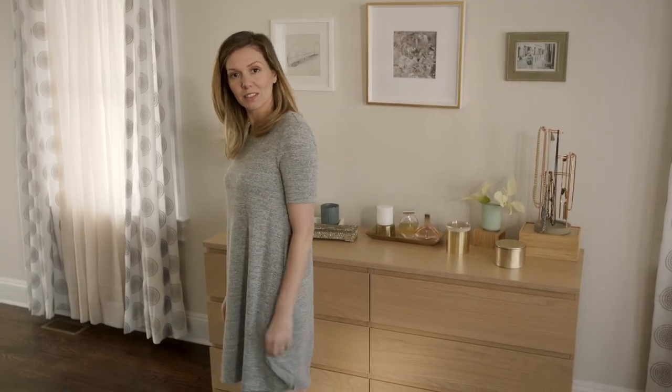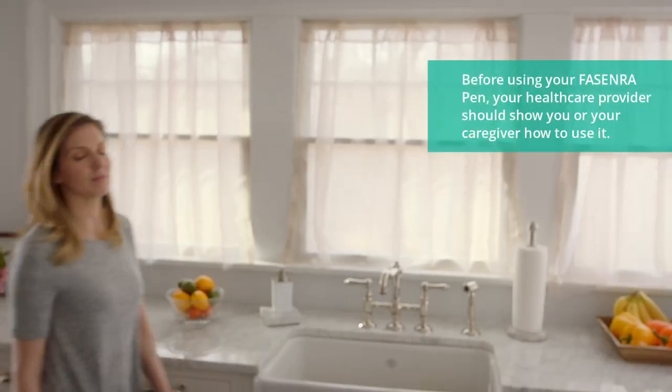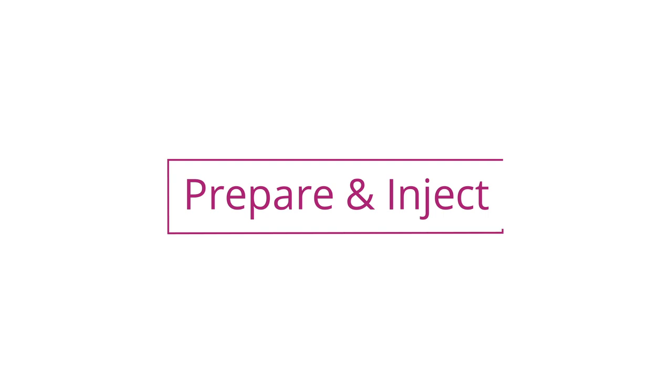I'm getting my Fasenra pen. You know, it's an injection for asthma like mine. Doesn't your doctor usually give you the injection? Well, she taught me how to do it. So now I can do it from home or anywhere. Cool. How does it work? It's really simple for me. I prepare and inject. Let me show you how it's done.